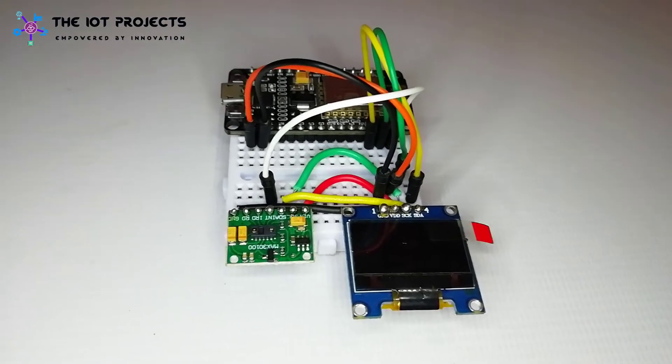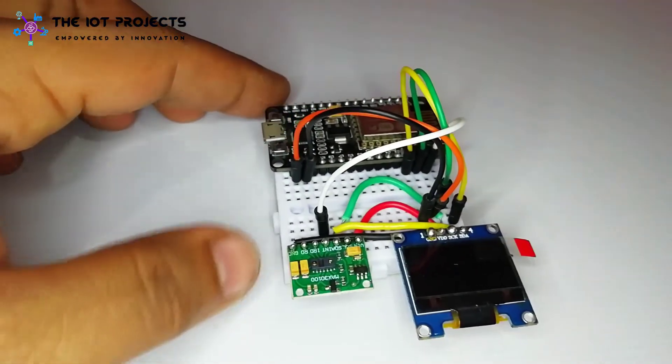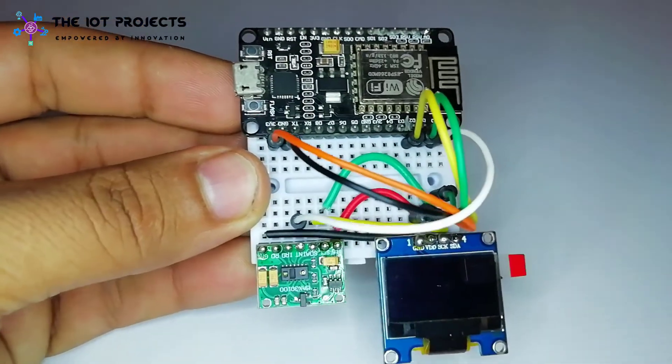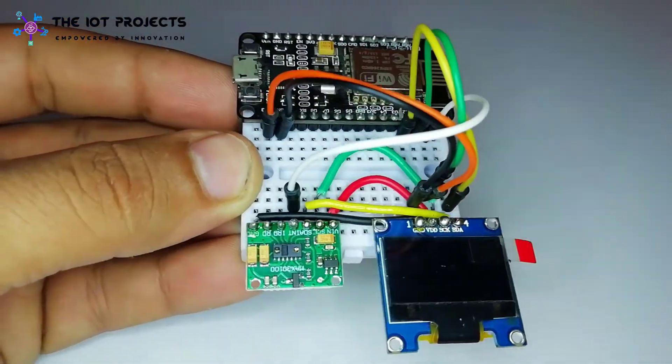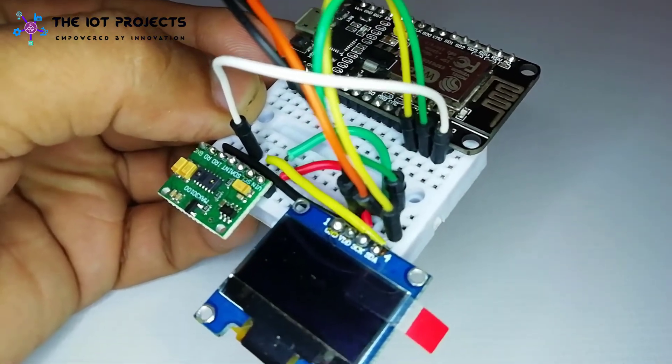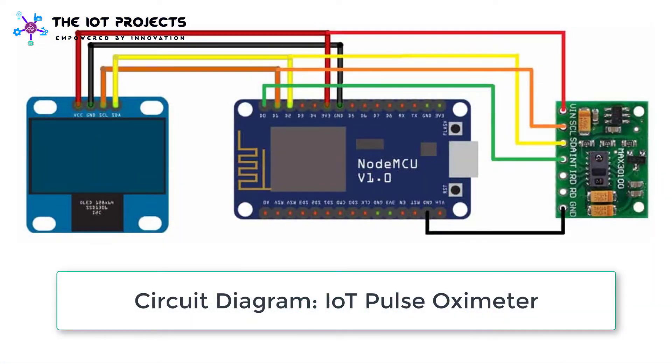The circuit assembly for this IoT pulse oximeter is very simple. Both the OLED display and MAX30100 oximeter sensor work with I2C bus. Interface the I2C pins — SCL and SDA — of both modules with the D1 and D2 pins of NodeMCU. Connect the INT pin of the oximeter sensor to the D3 pin of NodeMCU.